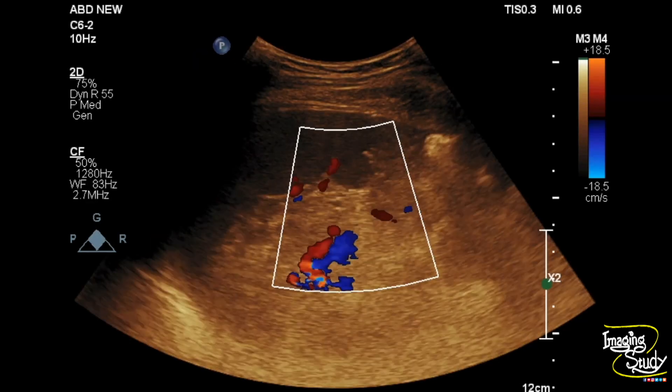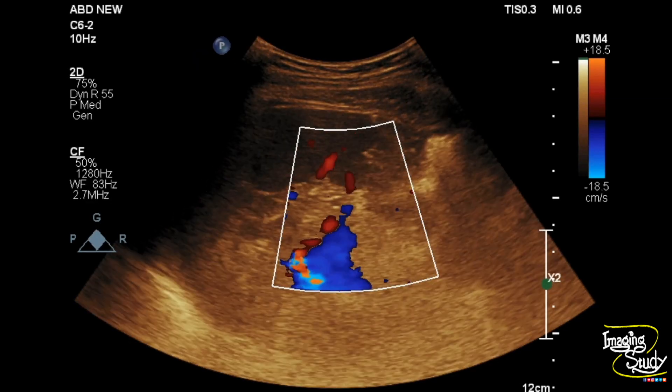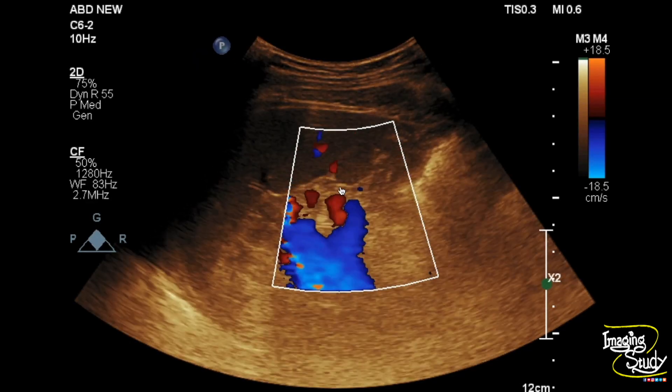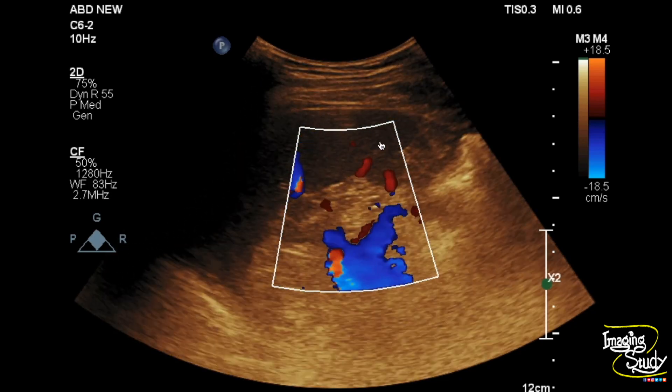If you check the color Doppler, you can see this structure is getting blood supply from the adjacent splenic hilar vessel.